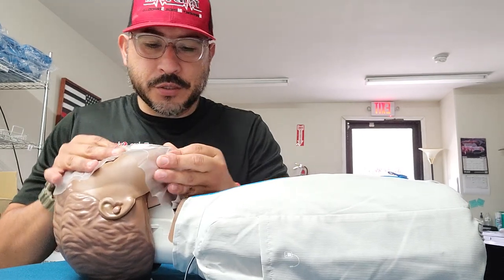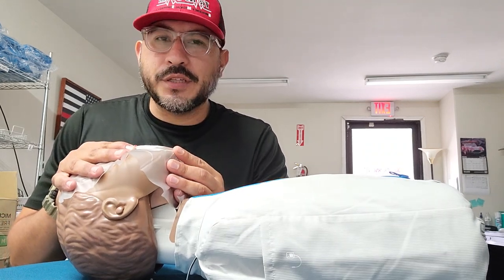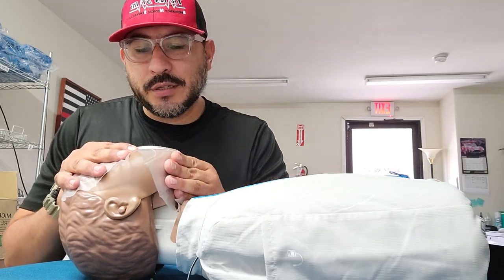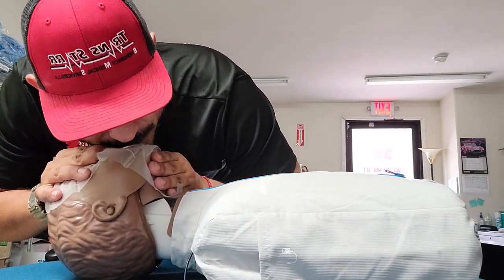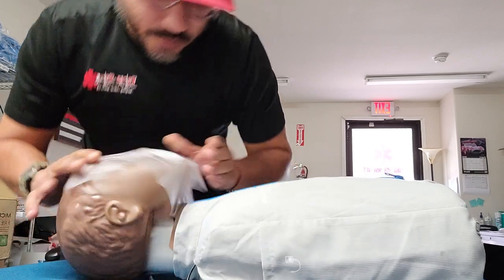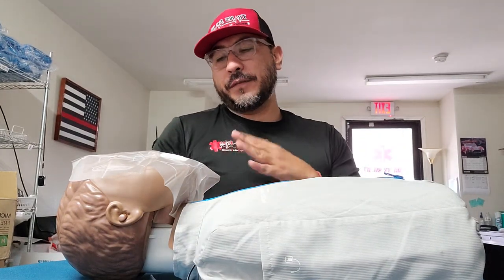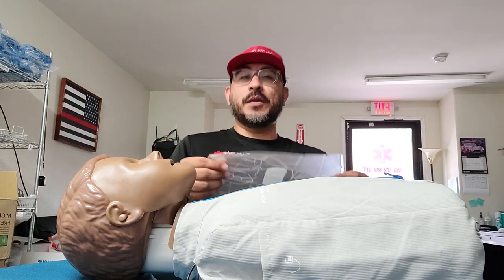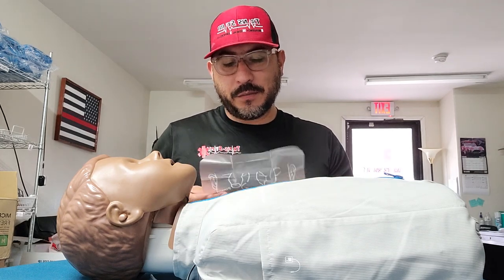You're going to be looking for that chest rise and fall, making sure it's going up and down adequately. Don't do forceful breaths — you want to be careful breathing into a child because you might have bigger lungs than the child, so you just need to give just enough. The breaths you're going to be delivering should be over one second — breathe in for one second, then make sure the chest is rising and falling. Check the pulse every two minutes. You don't want to lose that pulse, because then you have to advance to basic life support, which includes the compressions.